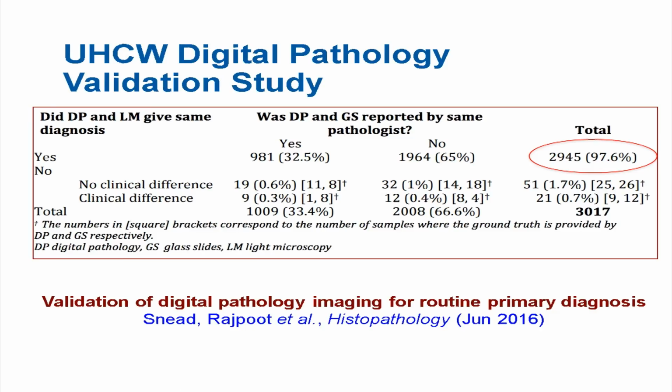This is our validation study, comparing digital pathology to glass slides and seeing how badly we did with it, and the answer was just as bad as with normal slides, really. So we made exactly the same number of mistakes. Sometimes we made the same mistakes.